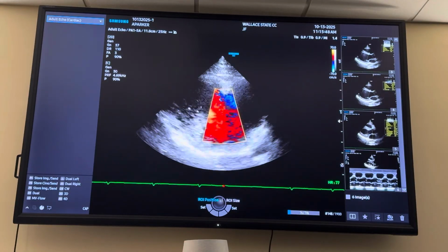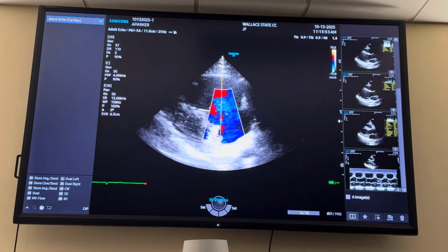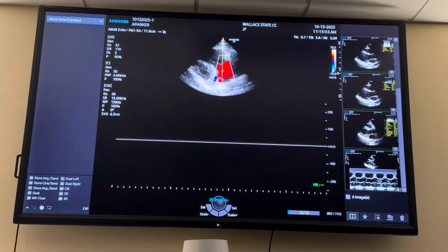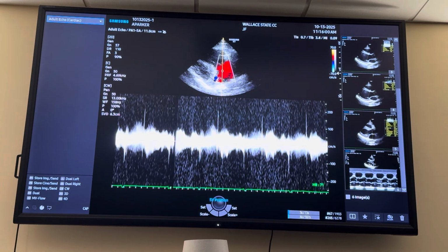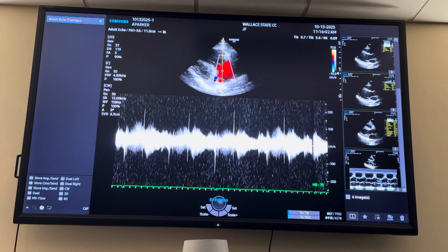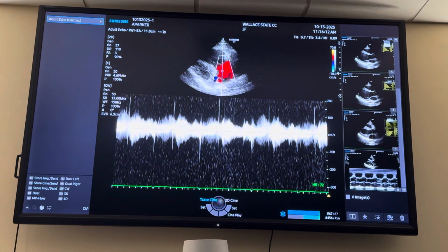You're gonna clip store here, and then you're gonna do continuous wave. Because what are we looking for here in continuous wave? Anybody know this? What are we looking for here if we do continuous wave? Does anybody have an idea what we might measure if she had it? Yes. Which I don't see any in this view. That's not to say that it does not exist. Sometimes you will see it only in one view. That's why we do it 3 different times essentially.